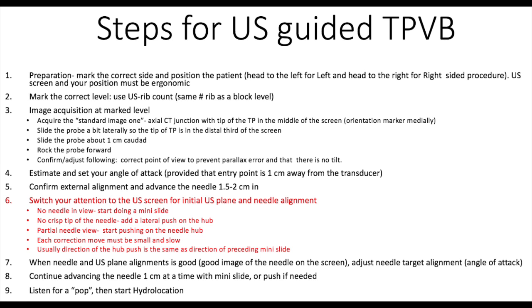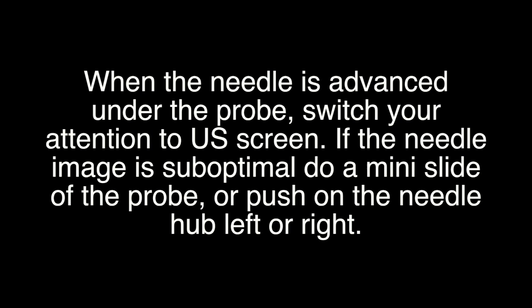Switch your attention to the ultrasound screen for initial ultrasound plane and needle alignment. When the needle is advanced under the probe, switch your attention to the ultrasound screen. If the needle image is suboptimal, do a mini slide of the probe or push on the needle hub left or right.